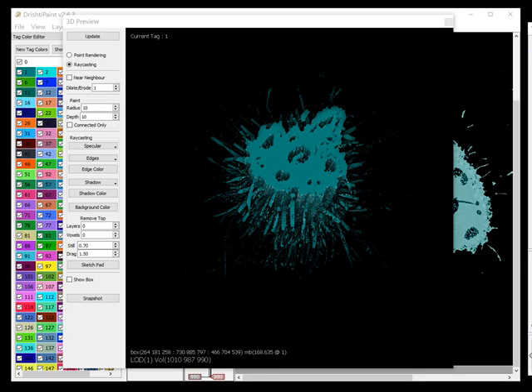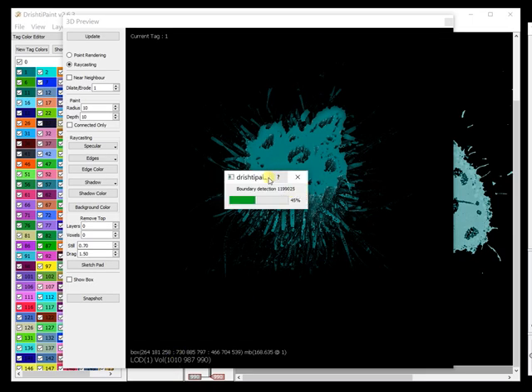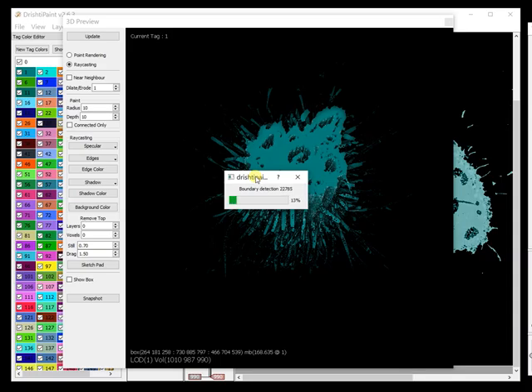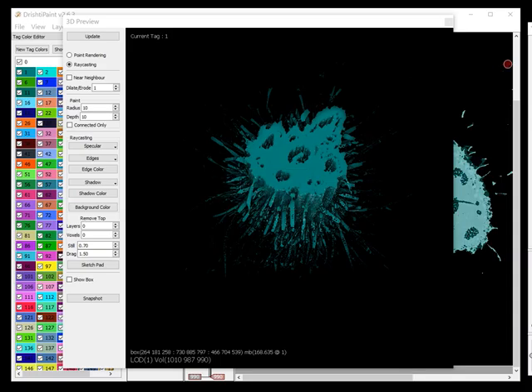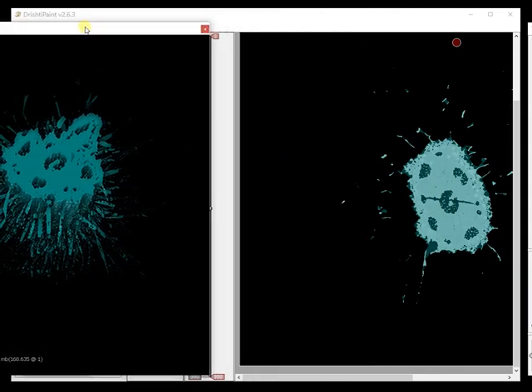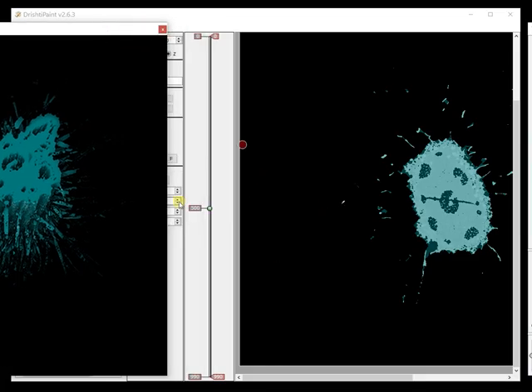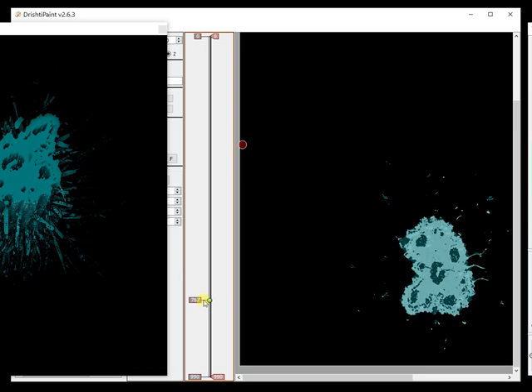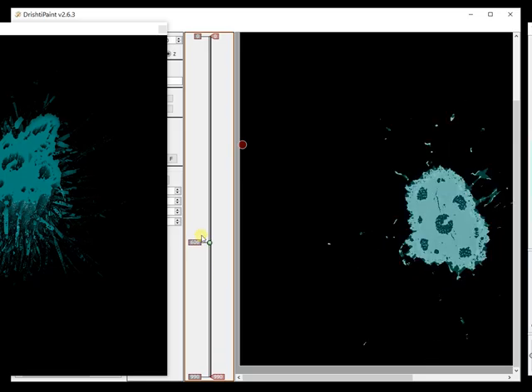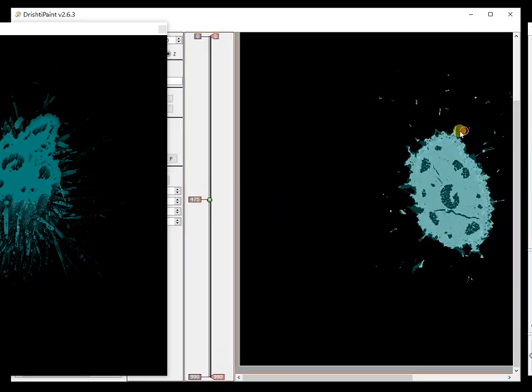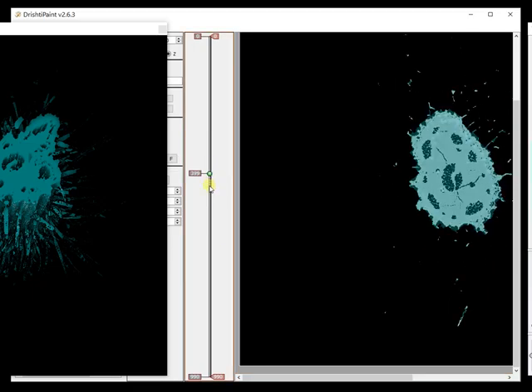It is still going on boundary detection. It can take a while for large data sets. One option is to take a subsample volume, apply the segmentation on that small volume and then back into the large volume. Now we have shrink wrapped it and as you can see we have closed the entire inside area.